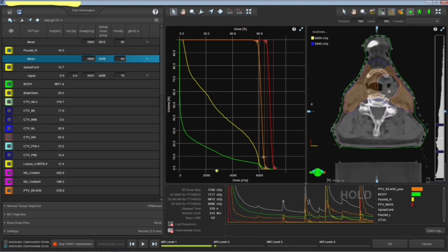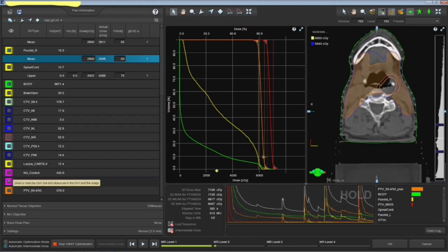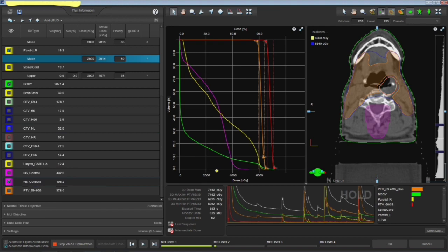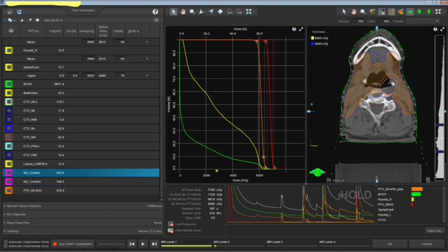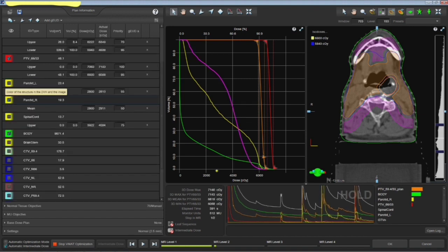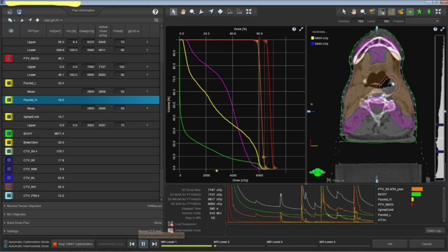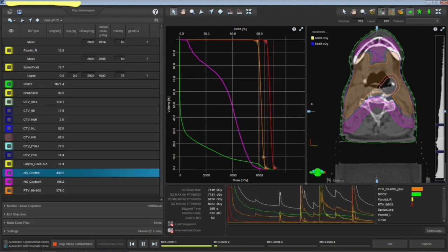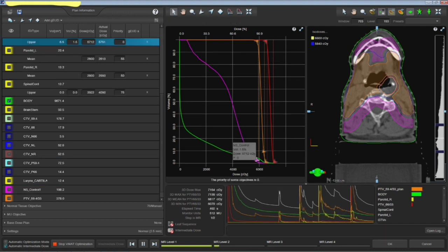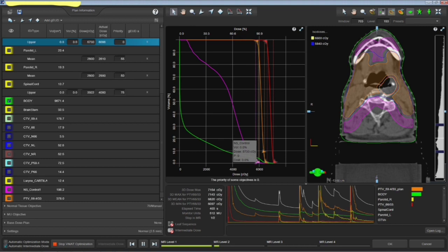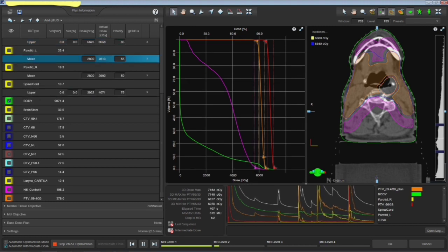Just a matter of understanding how much it is overlapping and how much that we can achieve, how less that we can achieve to the parotids and then the conformity. You have to just give the maximum dose less than the prescription dose, probably 2 Gy less than the maximum dose of the prescription dose, that's all.